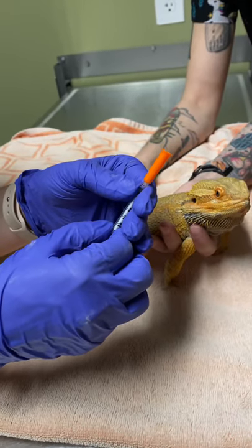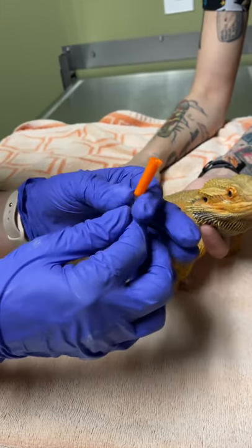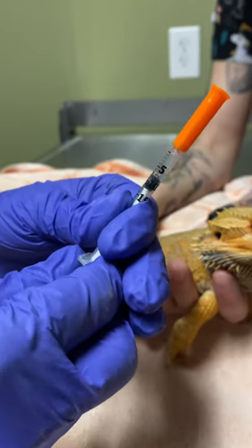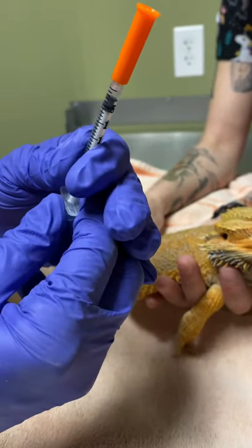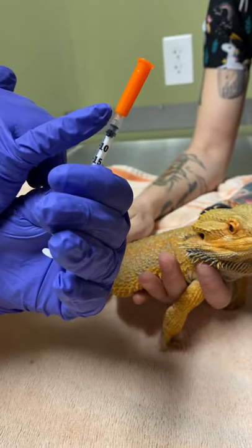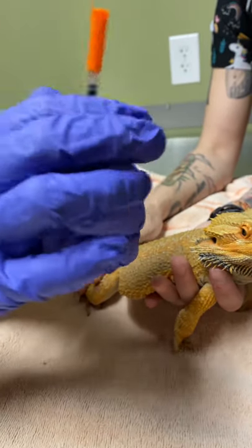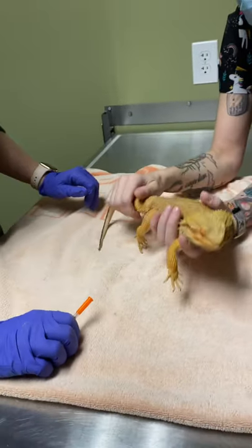This is Puffs specifically — he's only going to get a really tiny amount. I made sure there were no air bubbles, and I got it to the very tip. On the label it'll say what the amount is in the syringe and we can go over everything like that with you. Typically a lot of these injections are every 72 hours or three days, but it can vary.